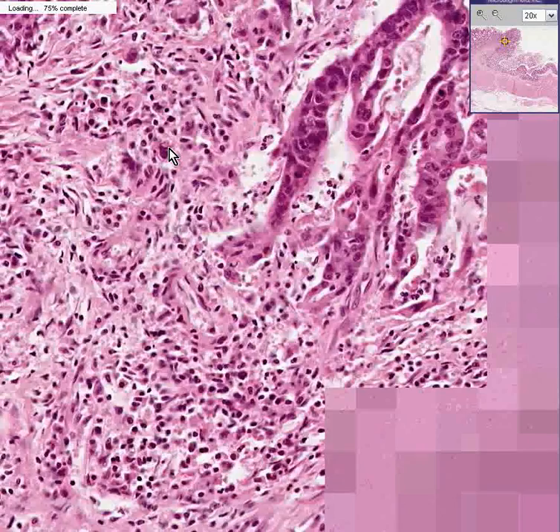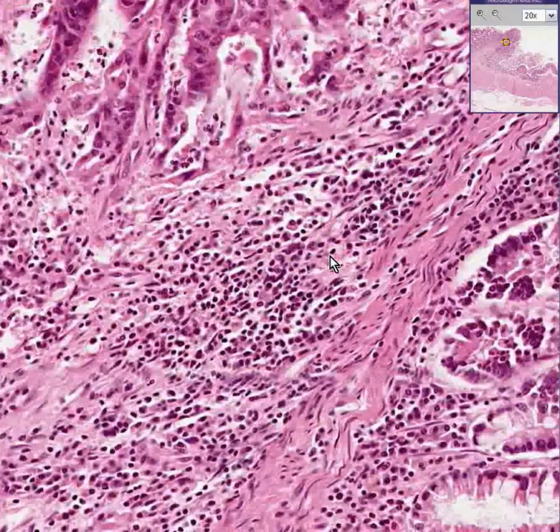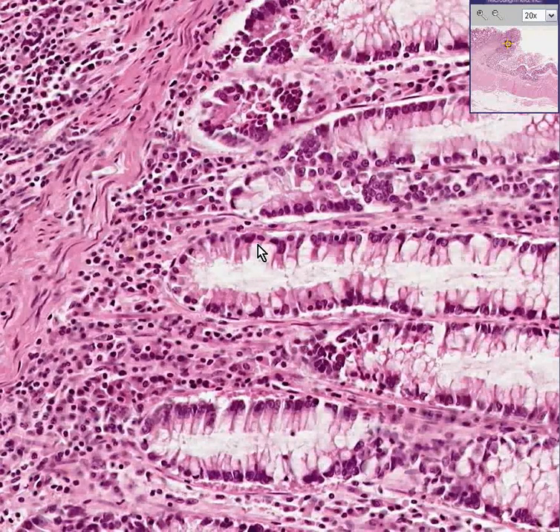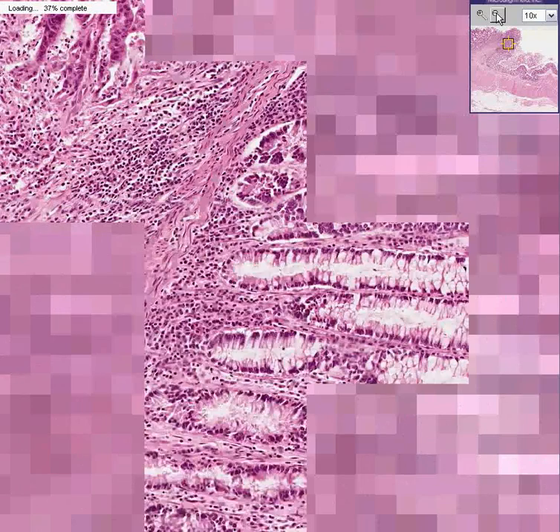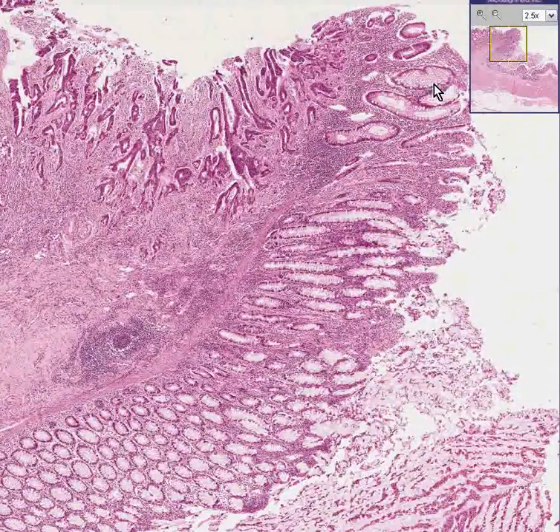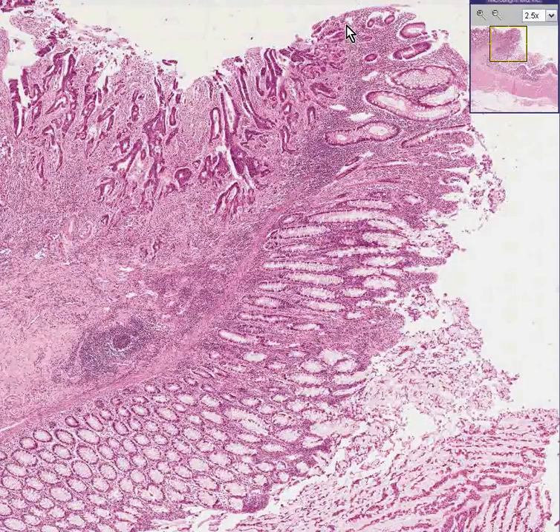However, when you go to the normal colonic glands for comparison, the ones that have not infiltrated the muscularis mucosa, notice how you see a nice mix with goblet cells. Notice how the nuclei are small. Notice how they stay towards the basal surface of the gland. And this is a classic demonstration to show you the marked difference between the way normal colonic mucosal glands should grow and differentiate versus the complete haphazard infiltrative process of an adenocarcinoma of the colon.